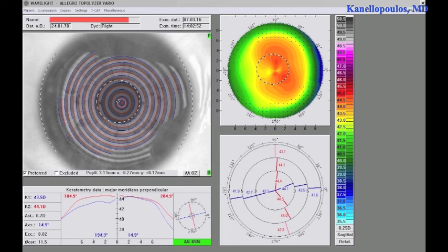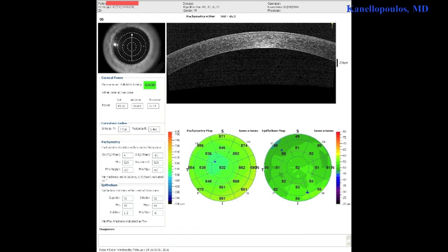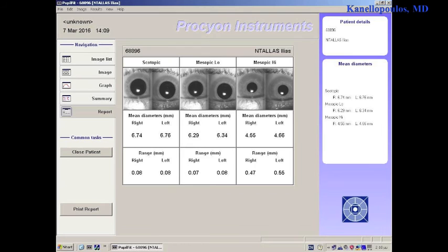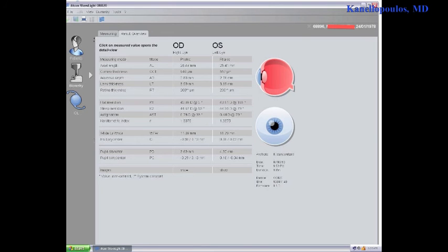And this is a topography that you can see that reveals some angle kappa, OCT to get a good view of the epithelium maps, Procyon, pupillometry, and then confirming the topographic astigmatism with the LENSTAR. Both eyes measured here.